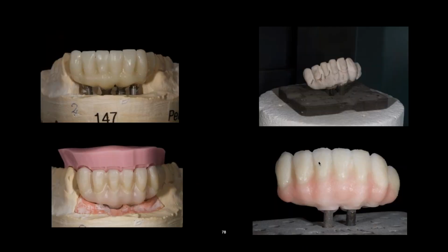Anyway, here's another one. When it comes to framework design, this is what I do. We use the PMMA material, we mill it out, we try that in the mouth, and we can see how we need to do the framework, cut it back, do whatever for the porcelain, and where we're going to put the gum.